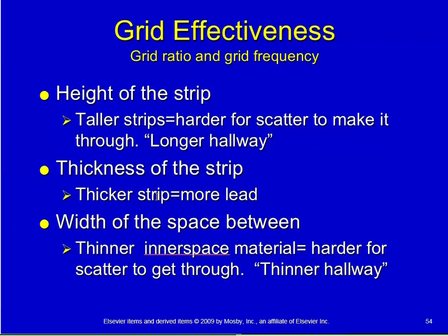So we just came through technique and thickness, and tissue thickness, and how to adjust your technique for the tissue thickness. As patient thickness increases, the patient absorbs more radiation of any type, right? We create more scatter radiation, but more of that scatter radiation is absorbed inside of the patient because of more possible interactions inside of the patient.